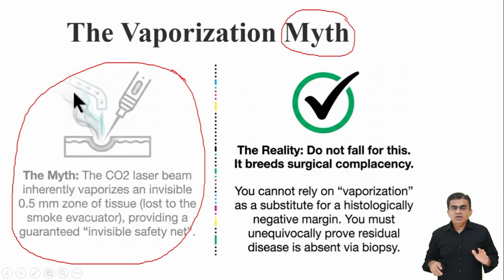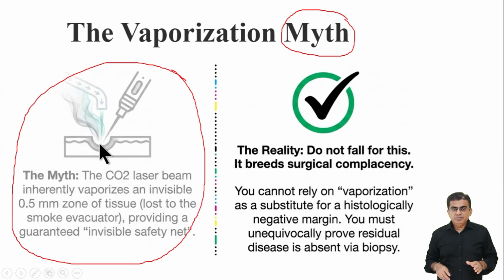You must never fall into this trap. Teaching our young residents that they have a guaranteed invisible safety zone will simply make them careless. You can never rely on this idea of vaporized tissue. It is not a substitute for a truly negative pathology report.